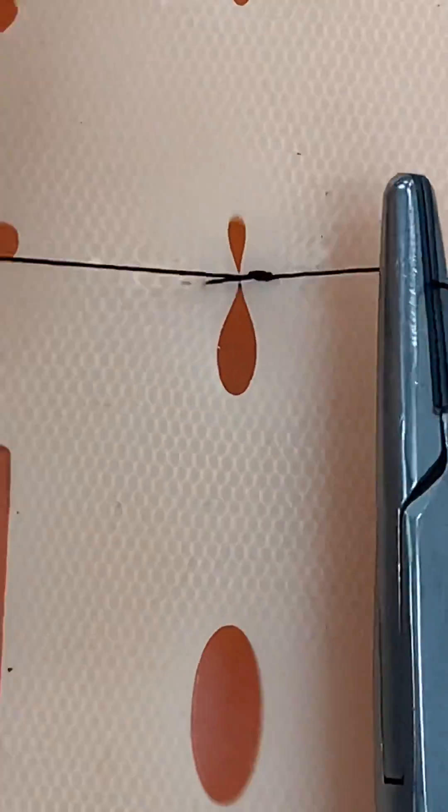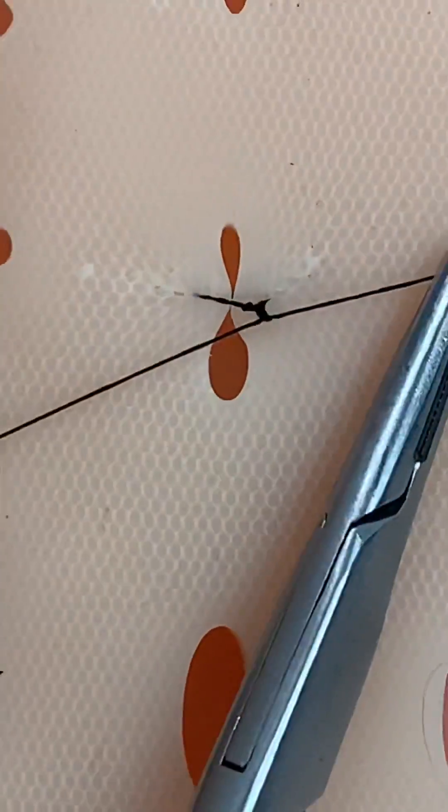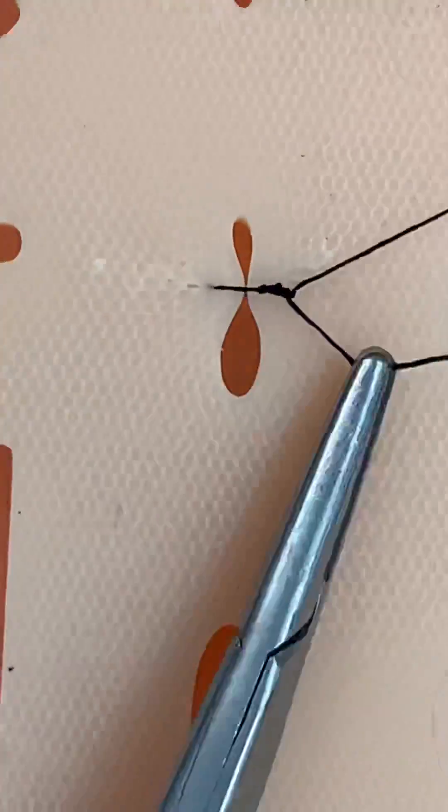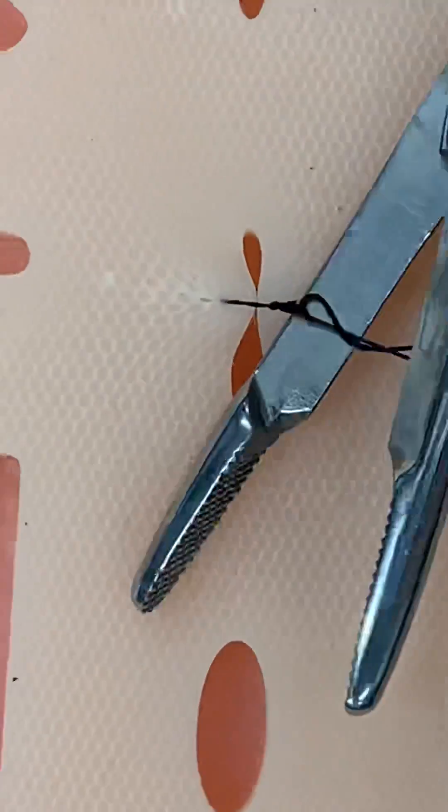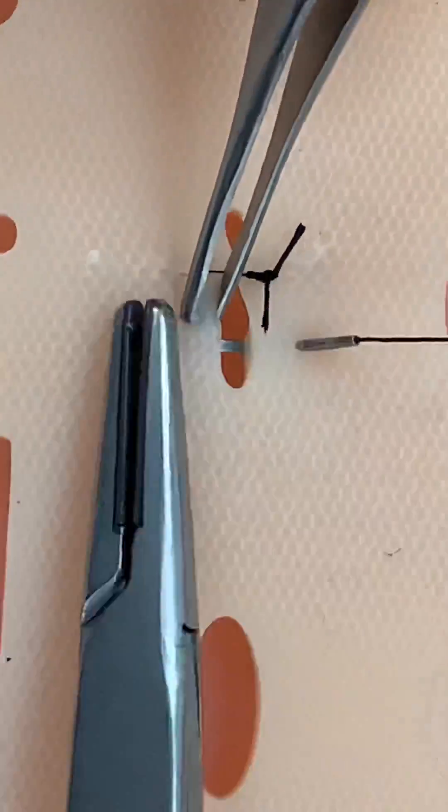This is then anchored in place using square knots with single throws. Four to ten of these are usually placed on top of the surgeon's knot. The ends can then be cut, but leave them long enough to prevent the knots from slipping. If I were to do the same without instruments, it would be much harder because of my fat fingers.